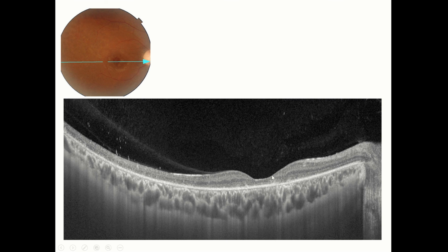If you want to find the outer plexiform layer, it is missing over this area of the retina, and there is shadowing with thinning of the retina. It produces shadowing, but the choroidal vessels are very prominently defined.